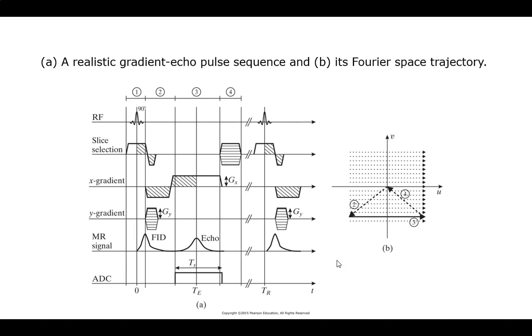So if you do it too long, guess what happens? It just stays at the origin better, right? If it was a little off and you were here, then all your errors build up. So could you save time? Yes. Could you get more noise or a mismeasurement? Yes. Now, does that mean it doesn't matter? No, it might actually be worth it to me to be able to do that type of a system, right?